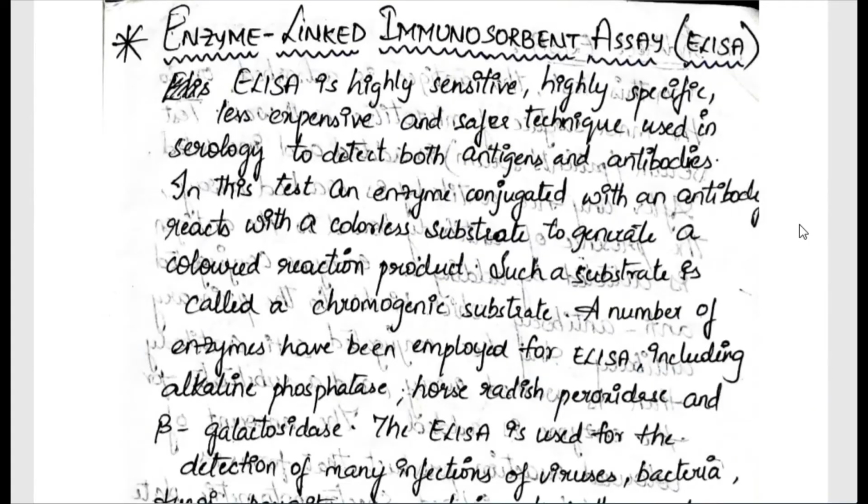Hi everyone. In the immunology subject, we were discussing types of antigens and antibody reactions. In that, we also started off discussing labeled immunoassays. The labeled immunoassays are of three types: enzyme linked immunosorbent assay, RIA and immunofluorescence. The RIA and immunofluorescence we discussed in the previous part, and in this part we are going to discuss the ELISA, which means enzyme linked immunosorbent assay.